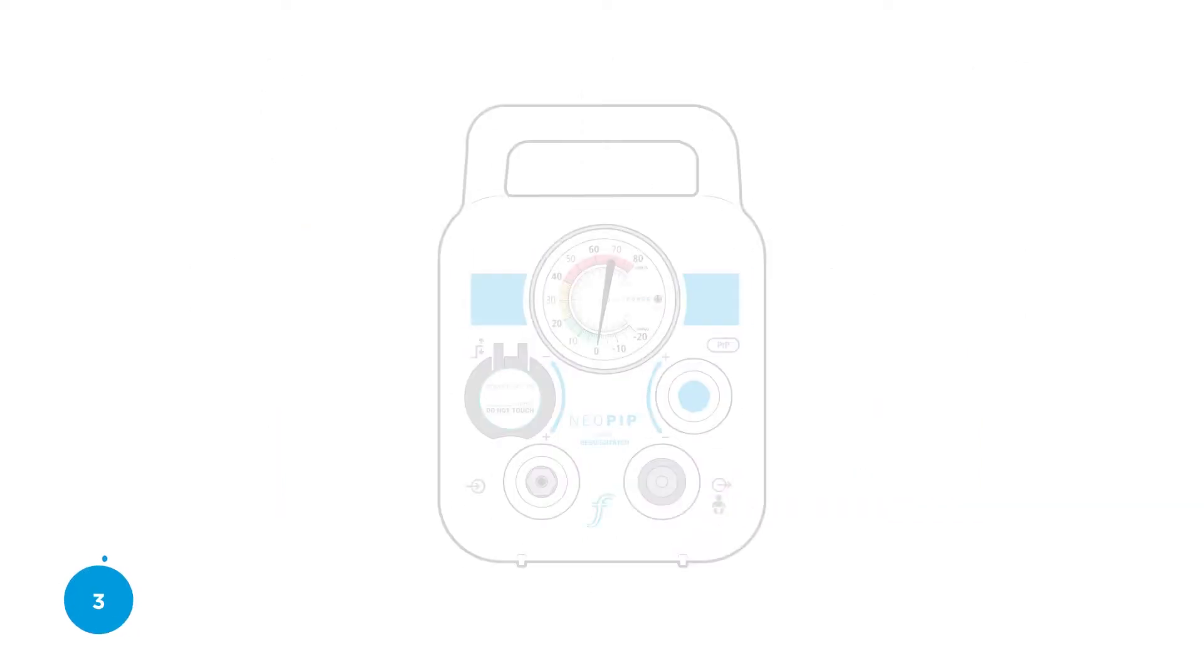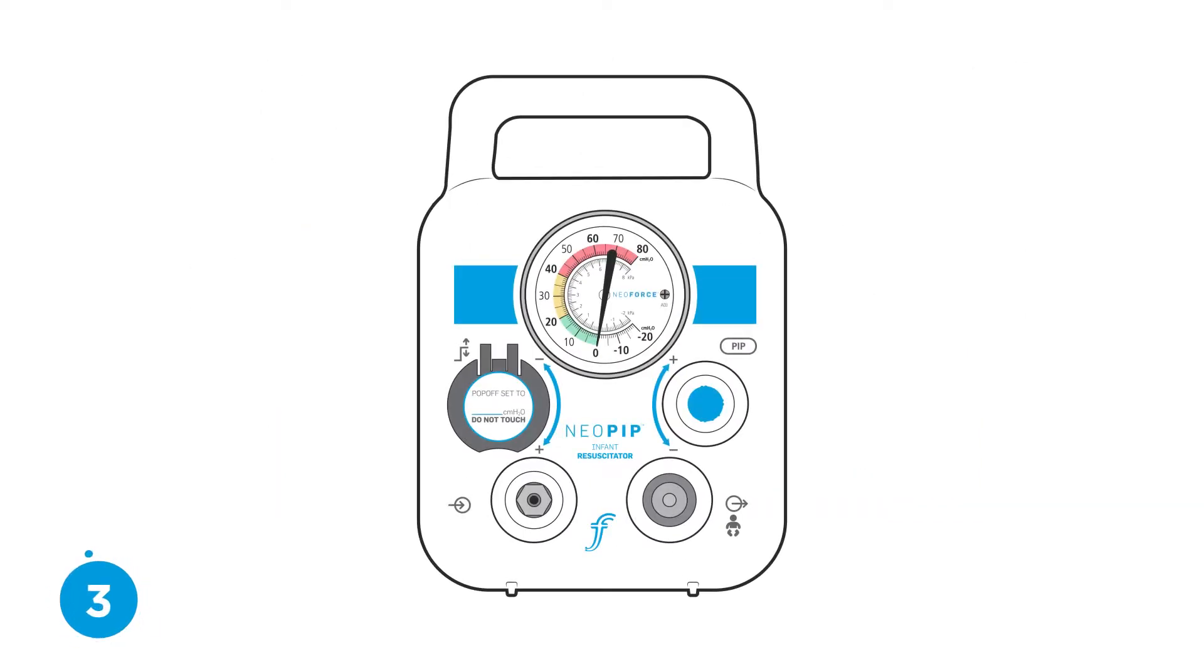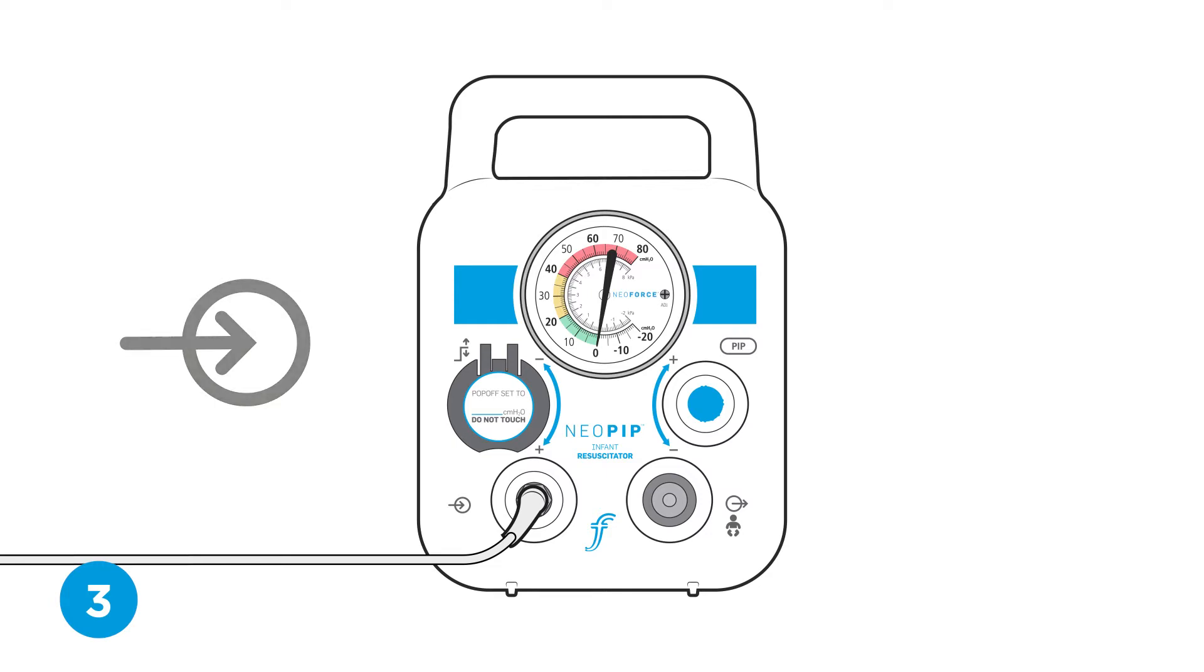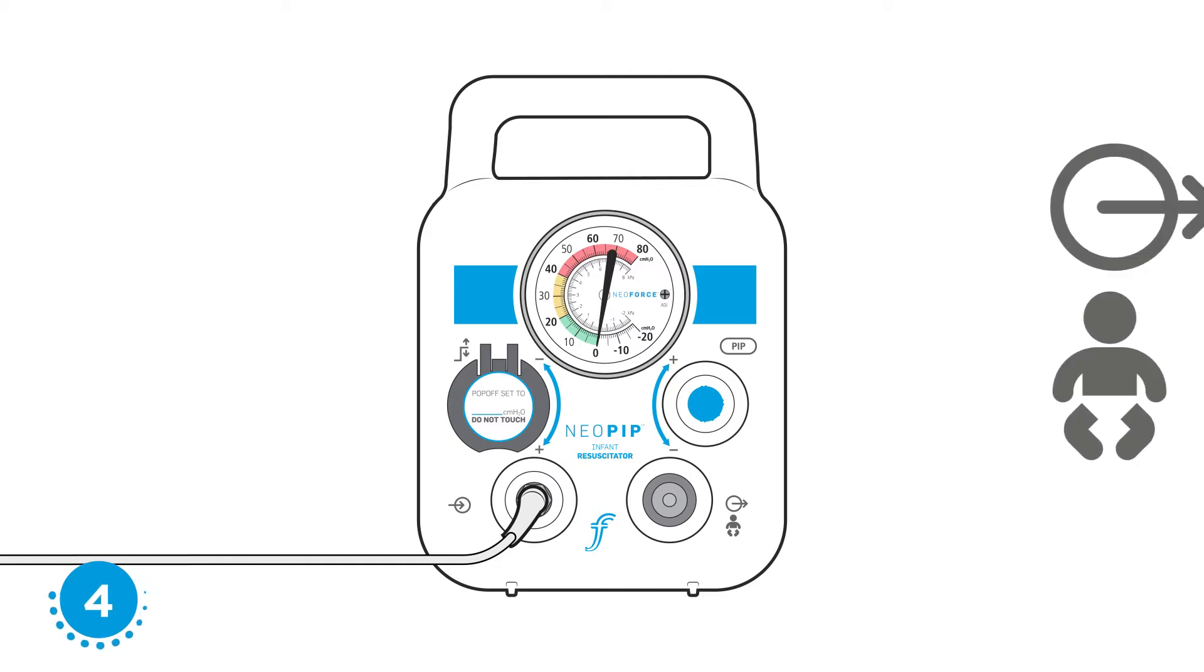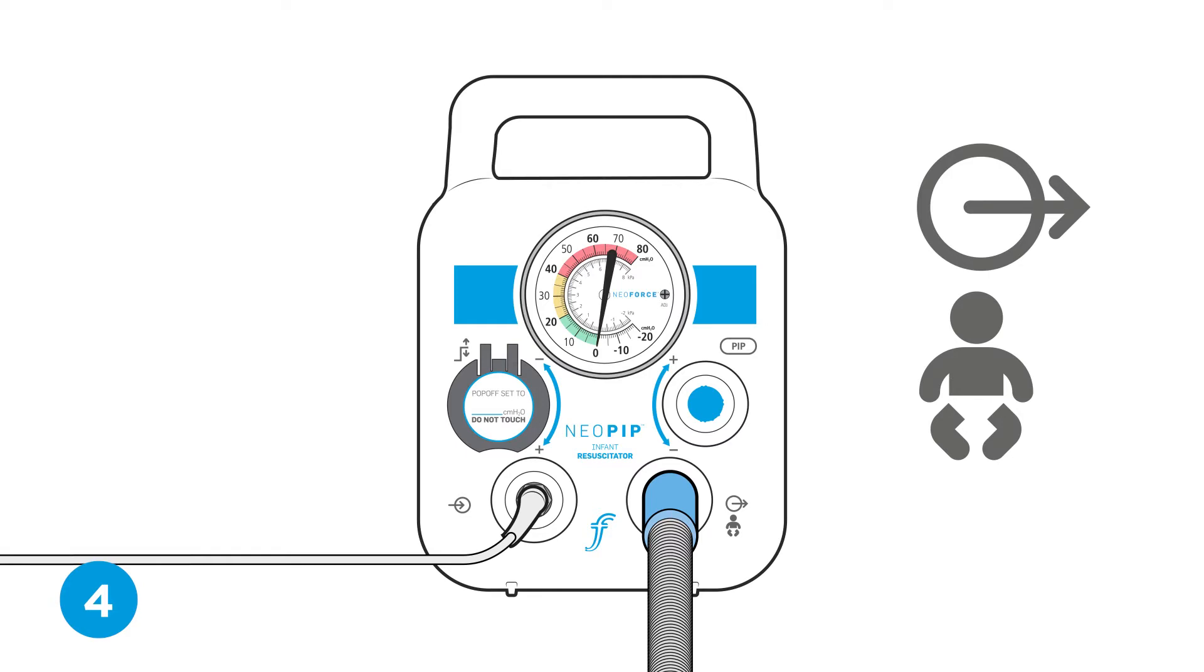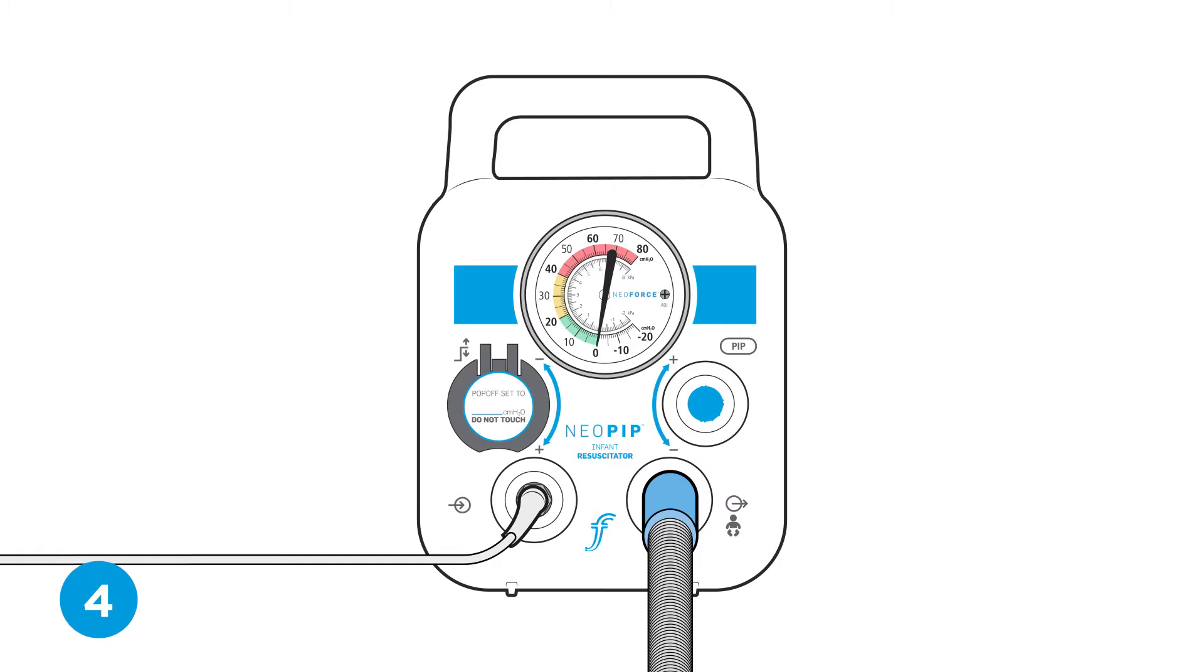Step three, connect gas supply. Connect the outlet of the flow meter or blender to the barbed gas inlet connector of the Neopip using standard gas supply tubing. Step four, connect patient circuit. Connect the resuscitation TP circuit to the patient circuit connector of the Neopip. Leave the red cap connected to the TP circuit.